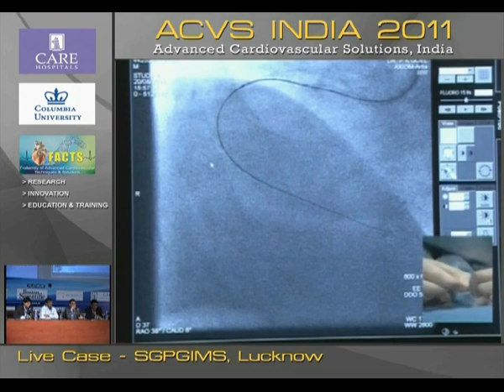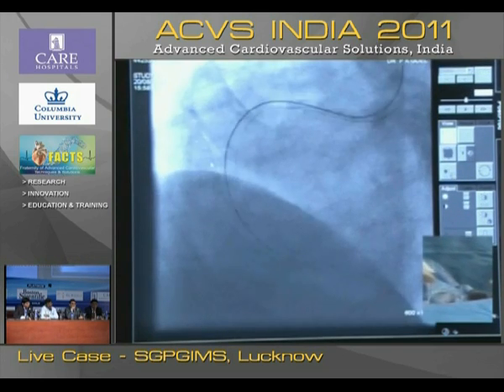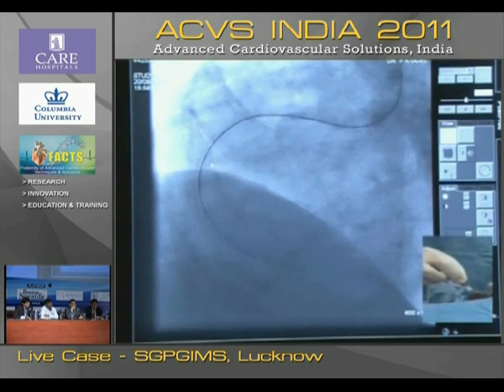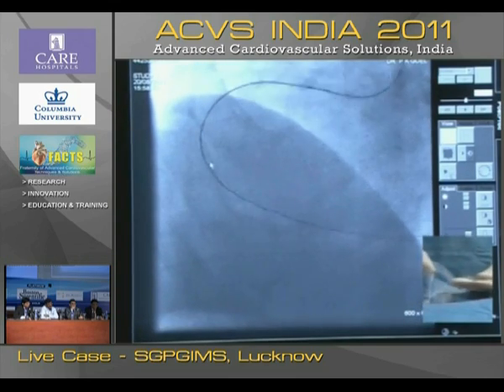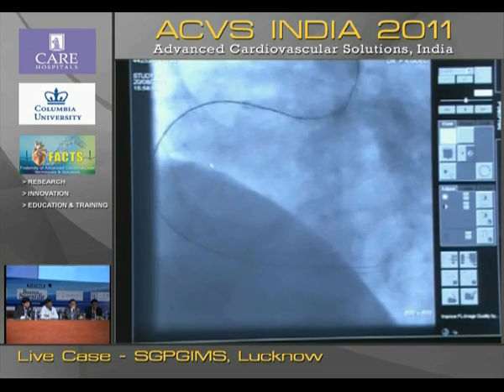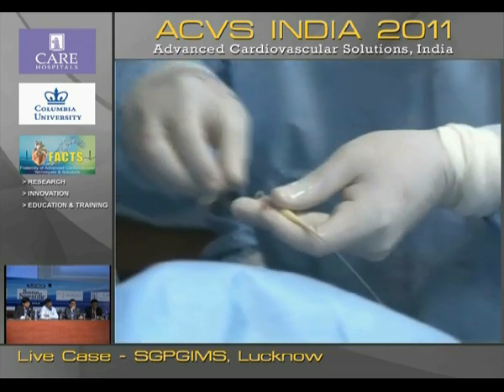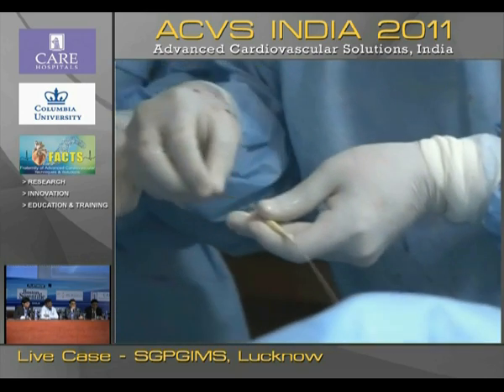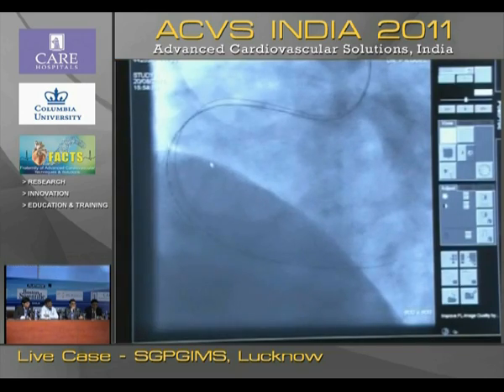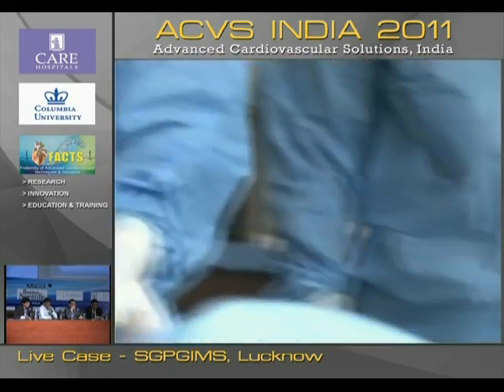Okay? Balloon trapping method. Yeah, please open it. Now, do not do any mischief with this wire. So the micro is coming back. Just close it when it comes. Close, close. Okay. Just hold on. All right. So now this extension goes out.